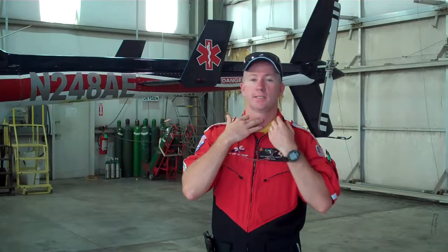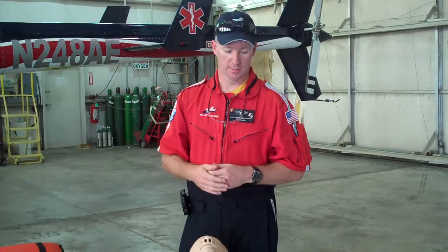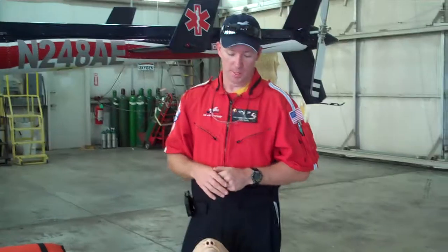There's other techniques, if the person's quite obese, you could pull the skin folds back to try to expose the larynx and see where that membrane is that we need to penetrate to put an airway in. Typically when this is occurring, it's a very stressful situation because this is the patient's last resort to get oxygen, and it's very stressful on the clinician performing this procedure. But typically it's a pretty easy procedure.